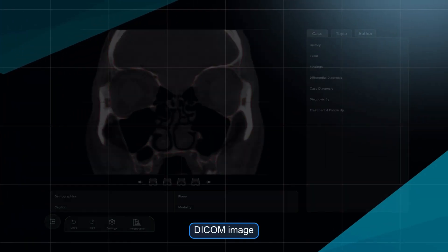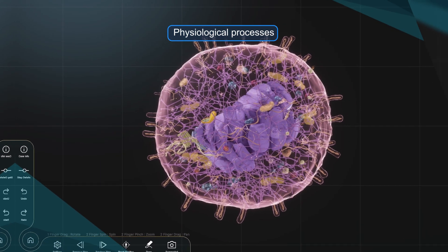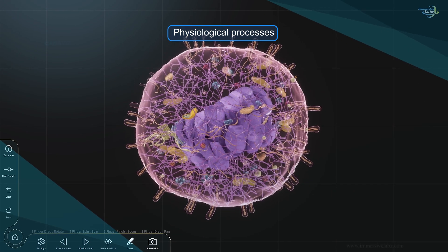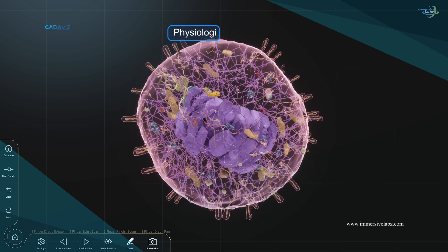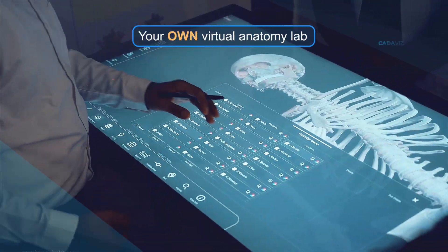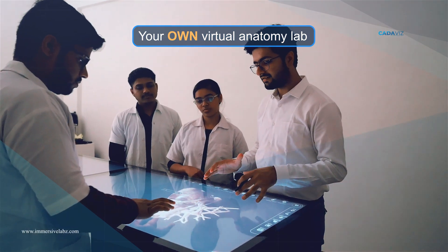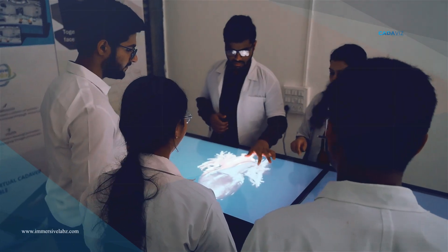Its special feature is DICOM image visualization to display a full 3D image. Detailed study of physiology and the processes in it. Convert your classroom into a virtual anatomy lab and try CADAVIZ now to learn the internal systems of the human body.